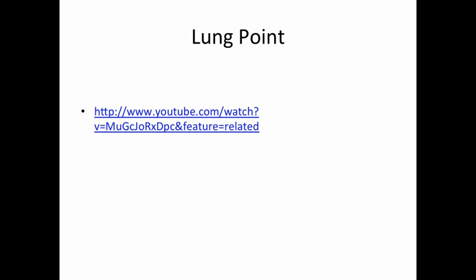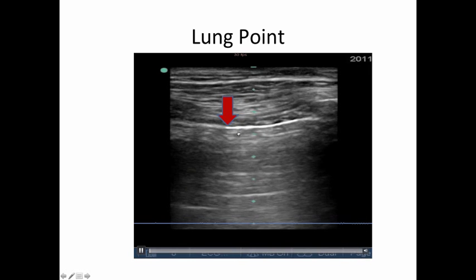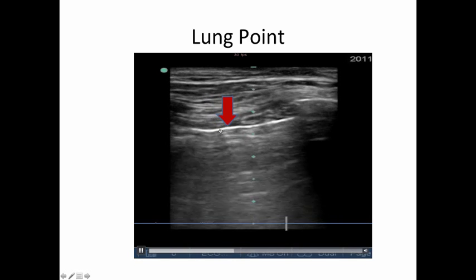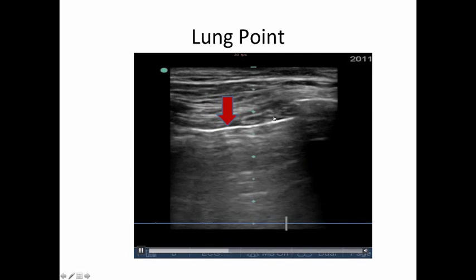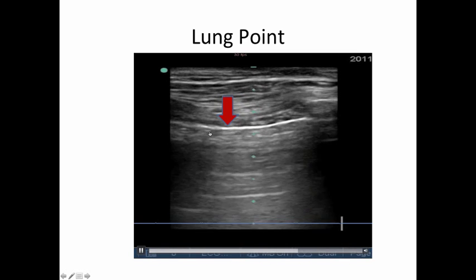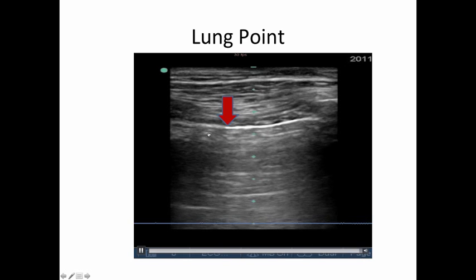And I have examples here of the lung point. So this was a patient that we had in the ICU sometime last year, and you can see it's sort of subtle, but this right side of the screen doesn't actually slide. It's just moving along with the intercostal muscles, while the left side of the screen is moving at a different pace here. You can see it sort of folding in on itself almost, the image.